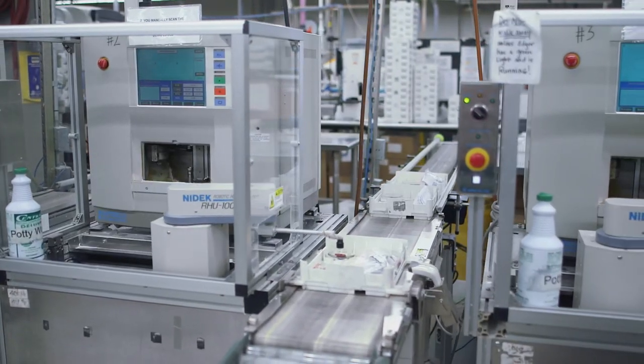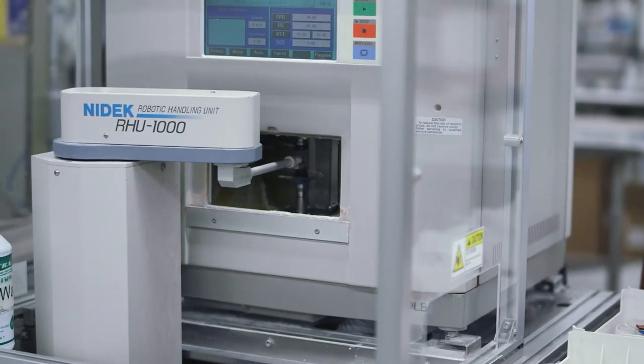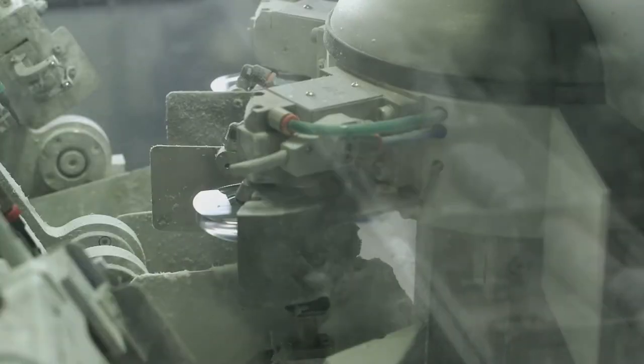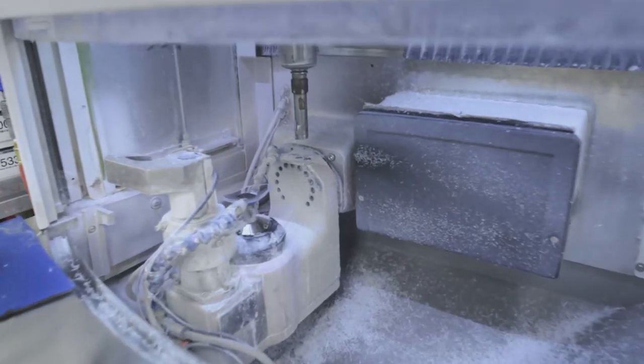The lens has now been ground, polished, and coated. The next step is edging. The edgers scan the tray barcode, retrieve tracing information, and edge the lenses to the shape of the frame in the tray. A specialty edger called the ES Curve Edger is used for specialty and wrap frames.